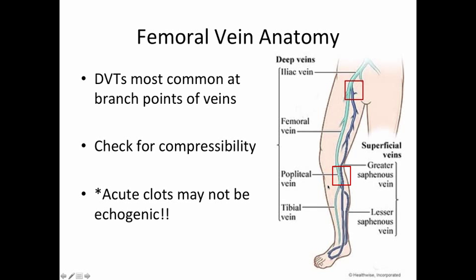And so when you order a vascular ultrasound, they go through systematically every 2 centimeters all the way down the leg. It's probably a bit excessive for what we have the time to do, and probably more information than you necessarily need to know for the most part. But if you're able to identify where the common femoral vein branches and where the popliteal vein branches, then that 2-point exam is actually pretty accurate.